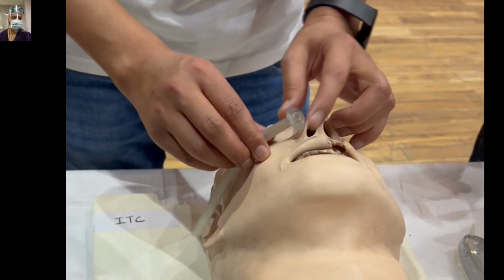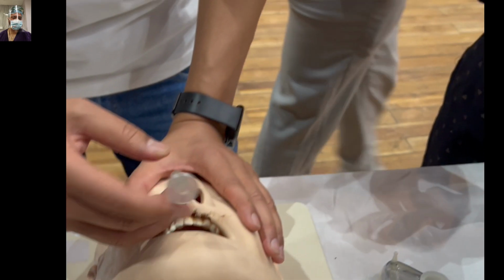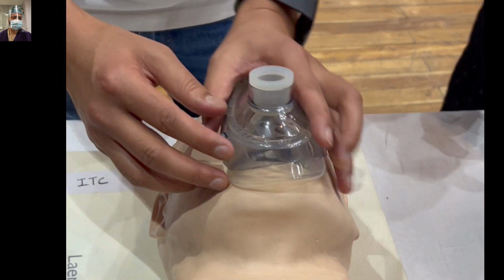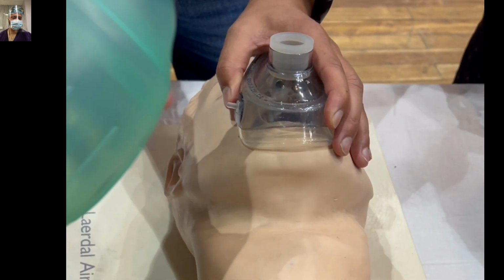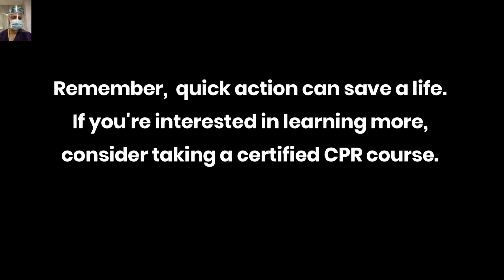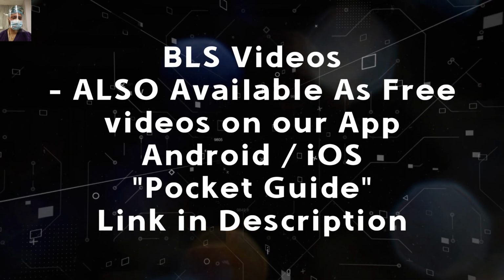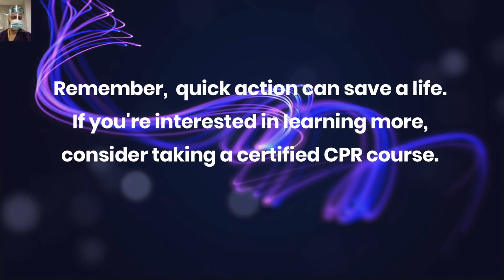Inserting a nasopharyngeal airway is a fundamental skill for any medical student in airway management. Remember to always choose the correct size, use adequate lubrication, and monitor the patient closely. With practice, you will be able to perform this procedure efficiently and safely. And despite all the efforts, if you are not able to secure the airway with the nasopharyngeal airway, then other methods of airway securing like the endotracheal tube or the emergency tracheostomy have to be considered.